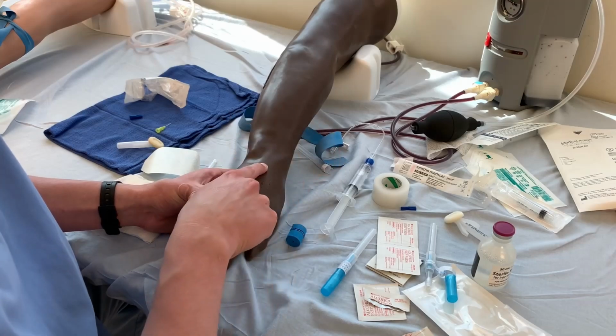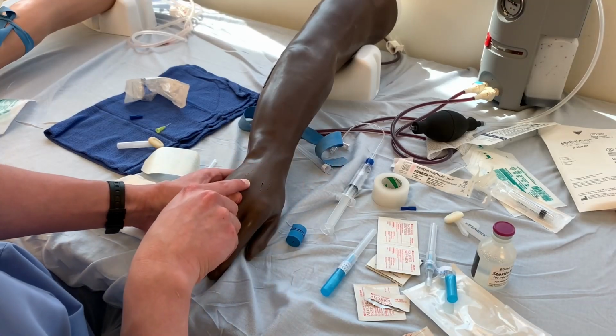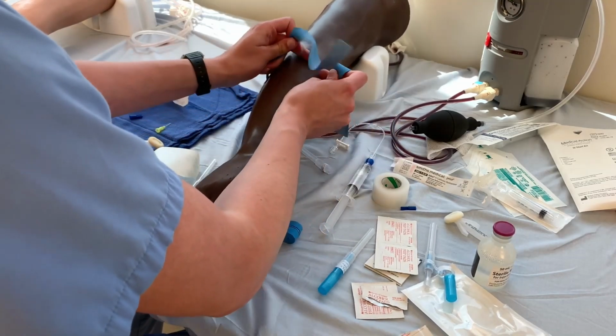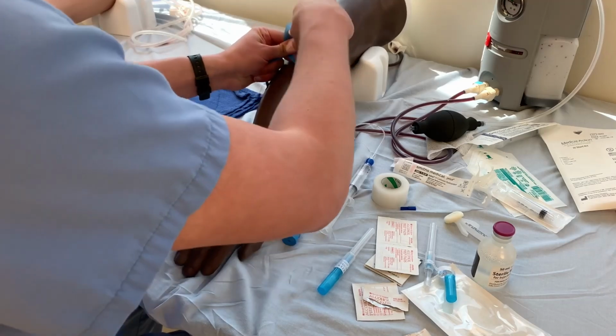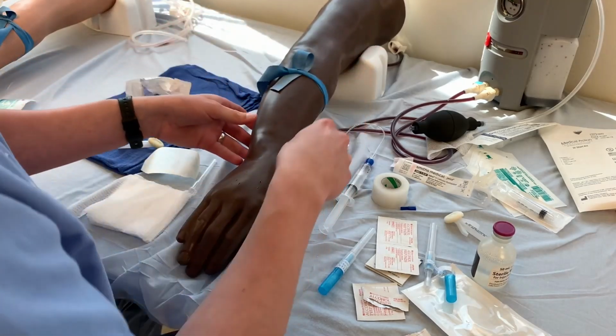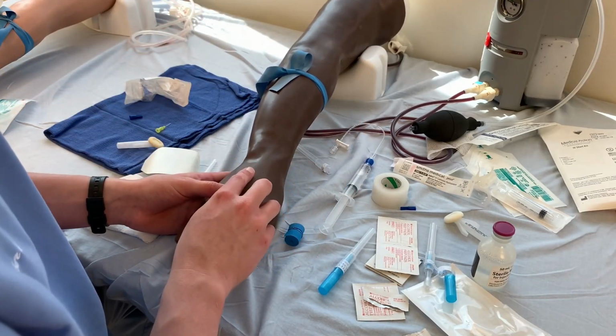Now for an IV. Just going ahead and picking out one that looks nice. Putting on our tourniquet. It's generally accepted that the tourniquet goes on at the beginning. However, when to remove the tourniquet, I've seen it every which way, so I just leave it on for the entirety of this.